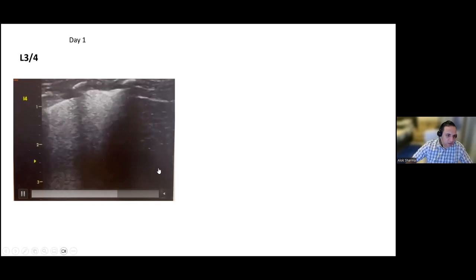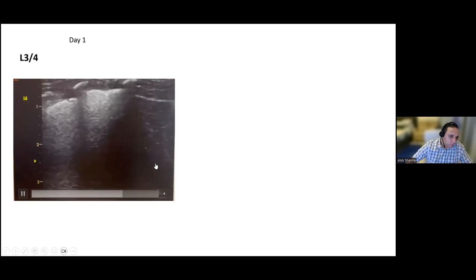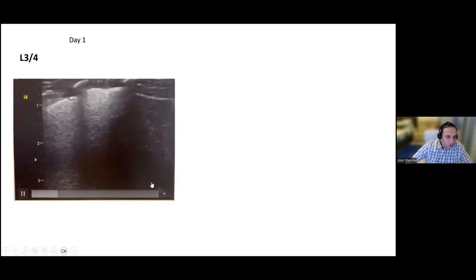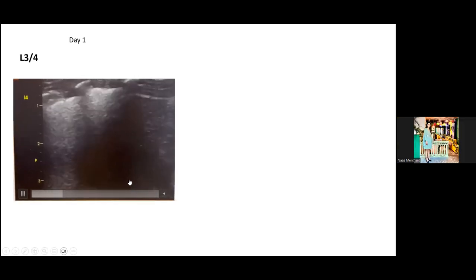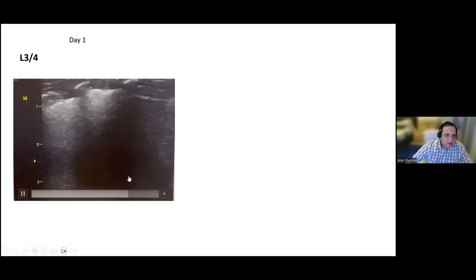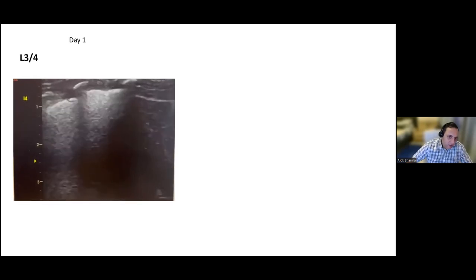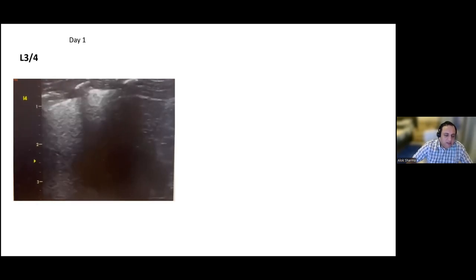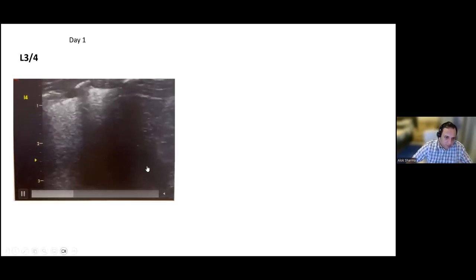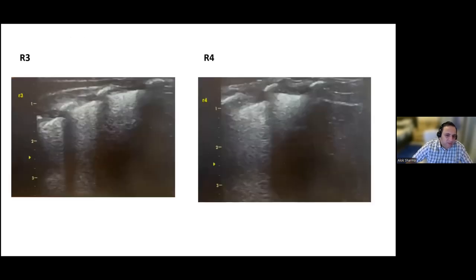My gut feeling, based on what you presented, is that that could be a mirror image artifact that you see over there, just at the bottom. And you've got dropout below the rib, which is giving you a very dark appearance. Normally, you're seeing this in L3, L4. If you have such a large area of consolidation, atelectasis, you should be able to see it in the L2 region as well. And if you're not seeing it, then the question is whether that's mirror image artifact. The only thing I'd say is the pleura looks a little bit thin.